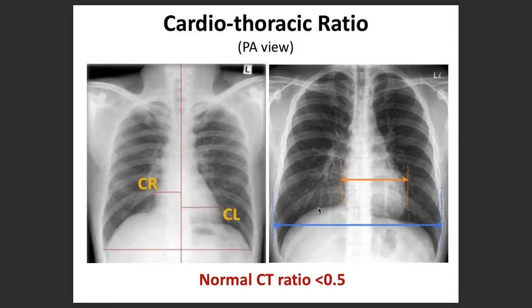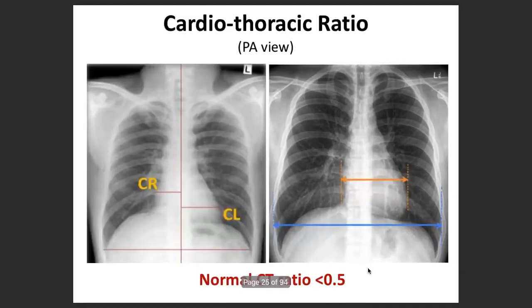Another very important concept is the Cardiothoracic Ratio, which is measured mostly in the PA view only. You draw a line from the midline and measure the distance on the right side and left side, then divide them. The normal CT ratio is less than 0.5. A helpful mnemonic: make a fist in front of the x-ray and point out the index finger and little finger — if the whole heart fits between them, the CT ratio is normal. If it goes beyond that, there may be cardiomegaly.